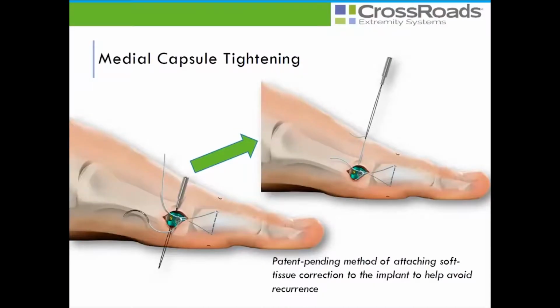Once you get your 2 screws placed, you have your osseous realignment. Now you can do your medial capsular repair, or maybe you do a percutaneous lateral release. Most times I use a 64 Beaver blade laterally to release the capsule.